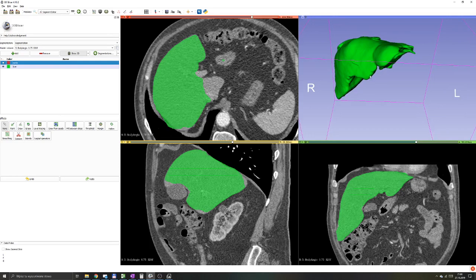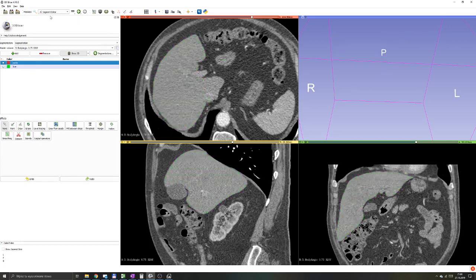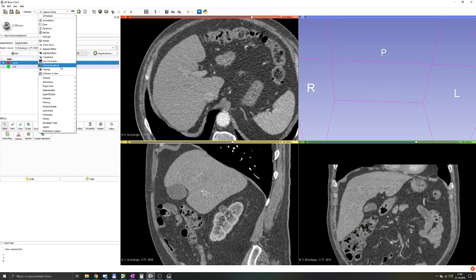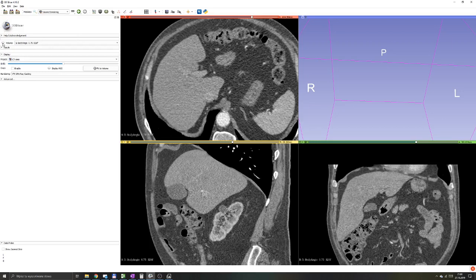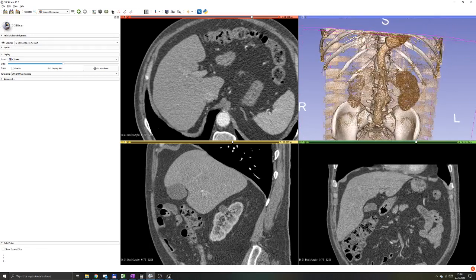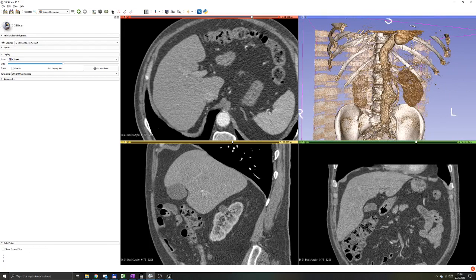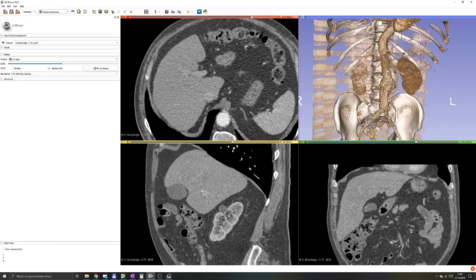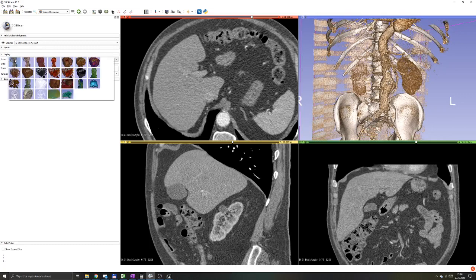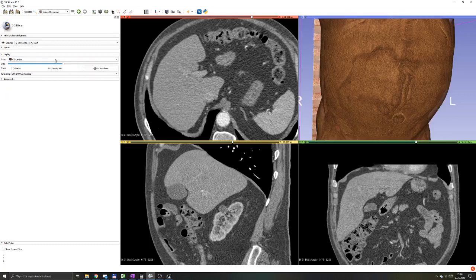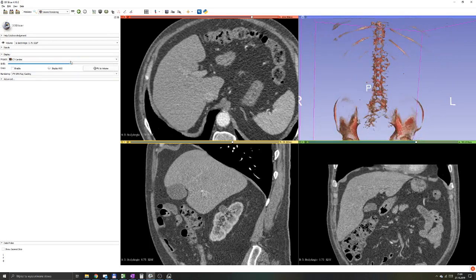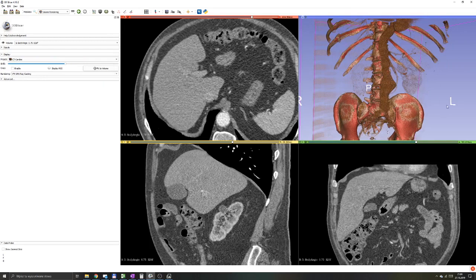But there is another way to visualize your 3D data — your CT scans, your MRI scans. I'm going to hide this segmented liver for now. In 3D Slicer you will find a module called volume rendering. When you go to volume rendering and click the little eye icon on the top left next to your volume, it will render the image. You might be surprised — it's pretty close to what we've done before. On the left-hand side you can choose a preset, pick the one most interesting to you, modify it a bit, and get a satisfying result.